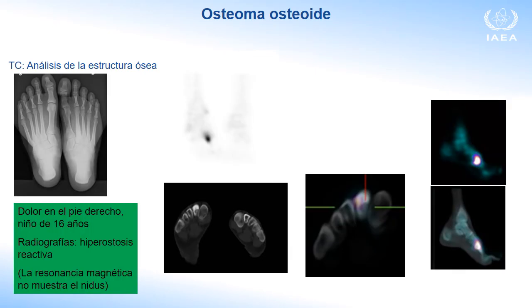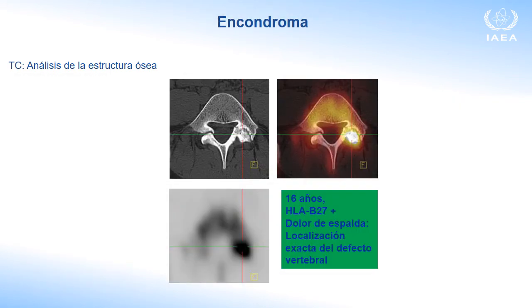In case of osteoid osteoma, also again, we have a typical site. Here, I don't think that CT can help too much. However, in some cases, and I have a personal experience of a suspected lesion by MR that was a simple osteoid osteoma.